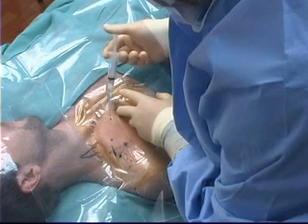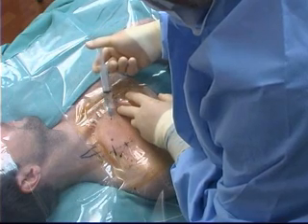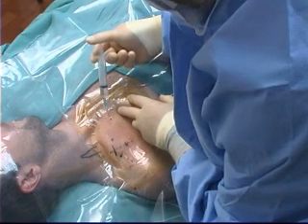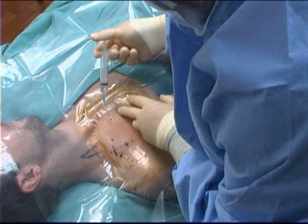The skin and subcutaneous tissue down to the level of the fascia that surrounds the major pectoral muscle and the intended path of tunneling is thoroughly anesthetized with lidocaine and 1 in 200,000 epinephrine. The epinephrine is added to reduce skin and subcutaneous bleeding.